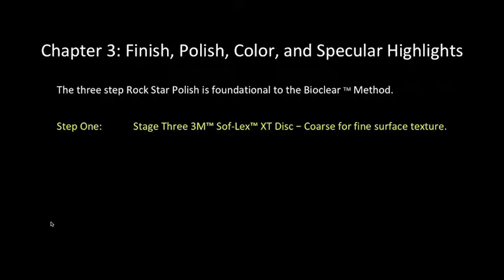that is now at the maximum flexibility and it has the finest texture. We're using that to really refine the surface texture of the restorations, and it's acting as our pre-polish. And I may be dating myself a little bit here, but those of you that have taken a wood shop class, you know when you're polishing your cutting board, you're going through the different grits of sandpaper, and so now we're at the finest grit of sandpaper before we actually do the final polish.